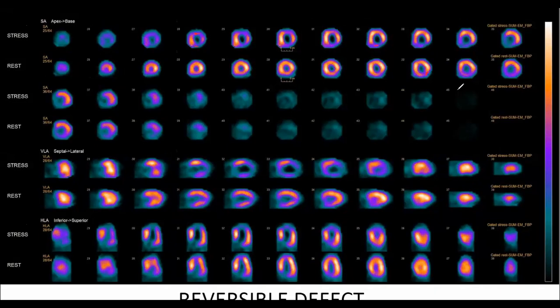And how are we going to distinguish? At the apex regions, we don't commonly see a good cavity. As you start seeing a good cavity, it is at the mid cavity level, and then as it's going to be blurred again, that means you are moving toward the base of the heart. So you have to understand it at the apical level, mid cavity level, and the basal level. And you are going to define where the defect is present.